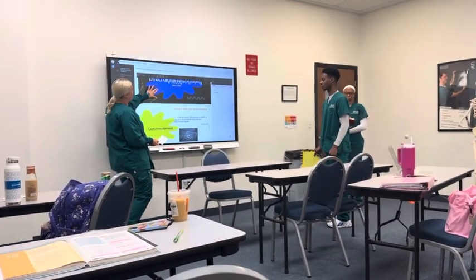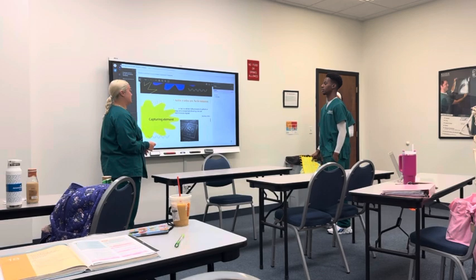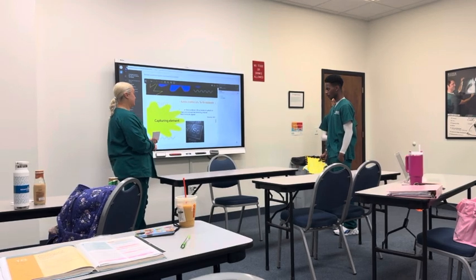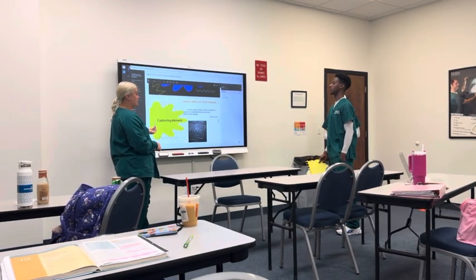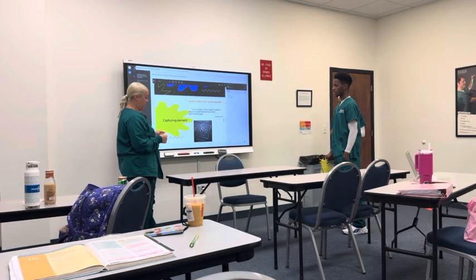So I'm going to talk about the coupling and capturing elements. Amorphous selenium is used in the DR process, in which X-rays are converted directly into an electrical signal. So we don't use a scintillator in this, but it's directly converted. Amorphous selenium is both the capture and coupling element in direct digital radiography.